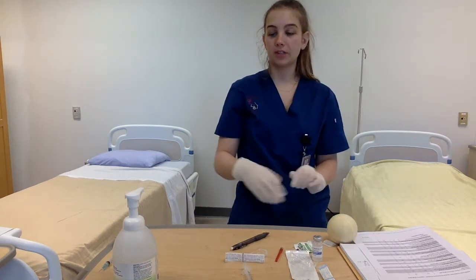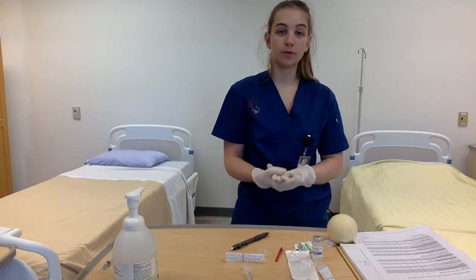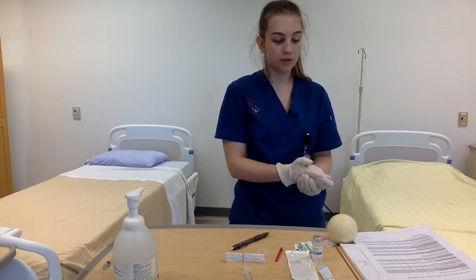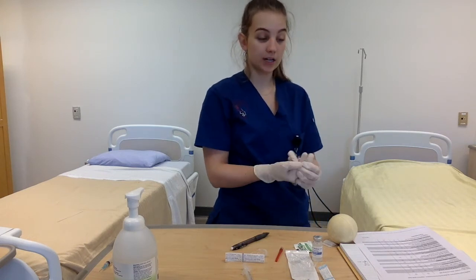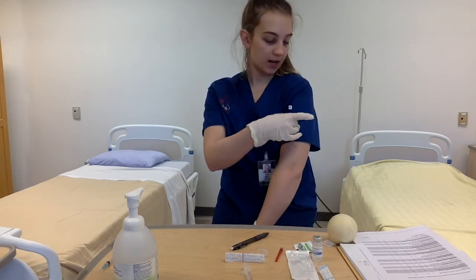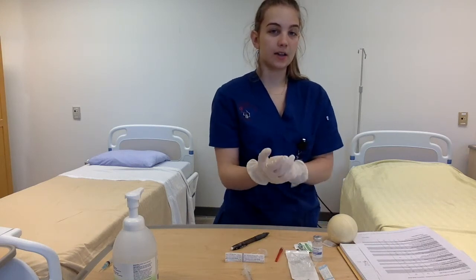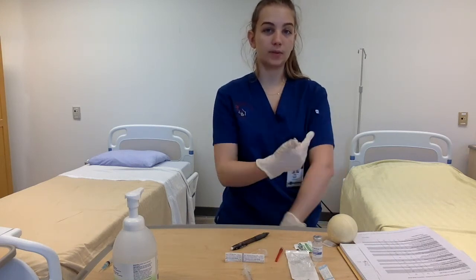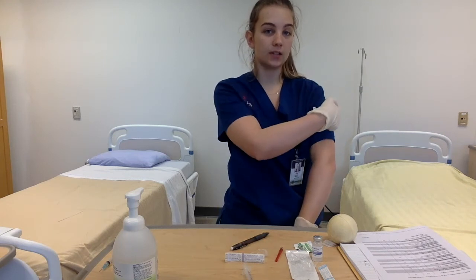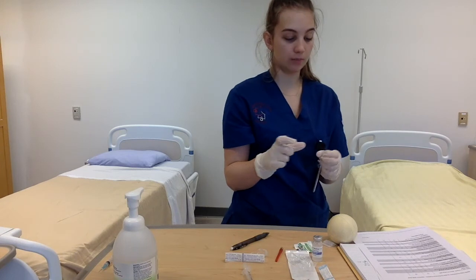Okay, now that I've properly discarded of the first injection that I gave, I'm ready to give the second one, which is an IM injection. So Mr. Mancini, this is going to be another needle. This time I'm going to give it in your arm, in this region right here, into your muscle. So this is because it's different from the subcutaneous injection, because this medication needs to go into the muscle, which is a little bit deeper into the body, so we need to use a bit bigger of a needle.